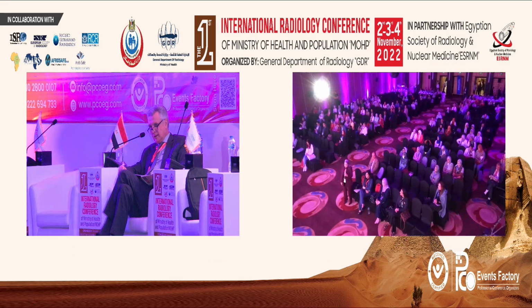Okay, good. And the second question is the rapid drop of the recall rate from 35% to 7%. This is huge. It's a difference over 7 years of work. How did you achieve this? Training and further training to the radiologists. We added AI also, which helped the less experienced radiologists. And we learn from our mistakes, definitely.